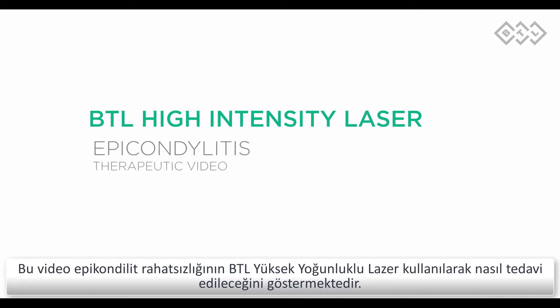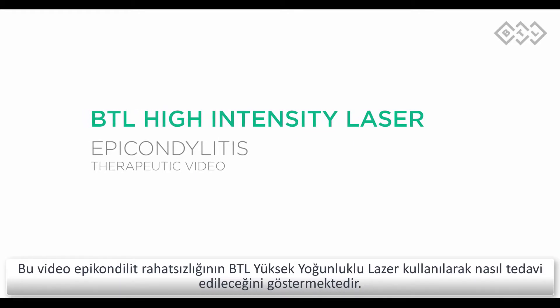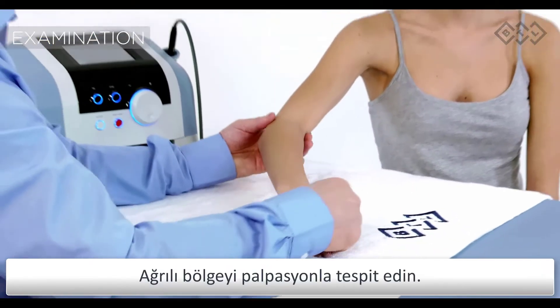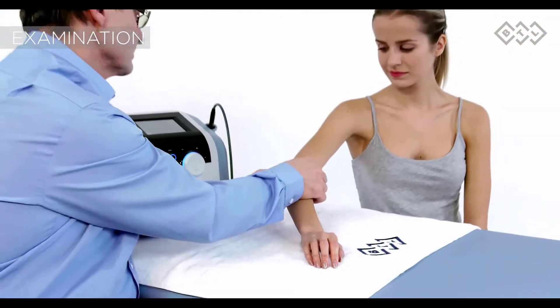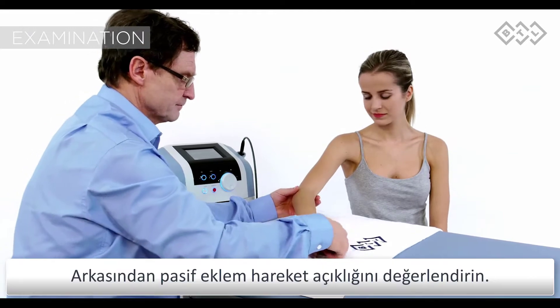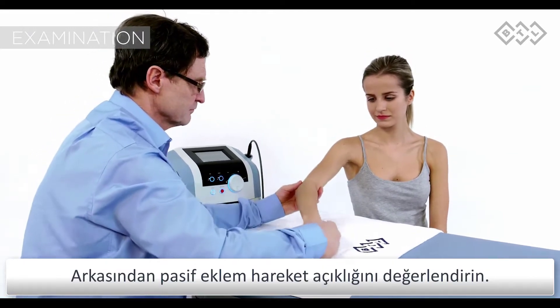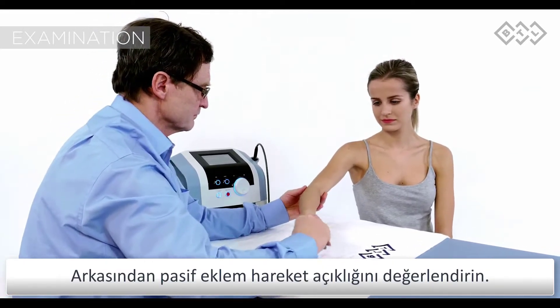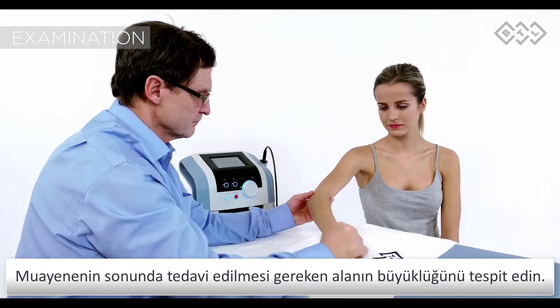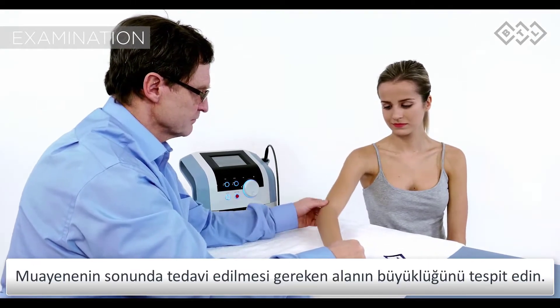This video will demonstrate the treatment of epicondylitis using the BTL high-intensity laser. Using manual palpation, locate the most painful spot. Conduct a passive examination of the joint range of motion limitation. At the end of the examination, define the area to be treated around the most painful spot.